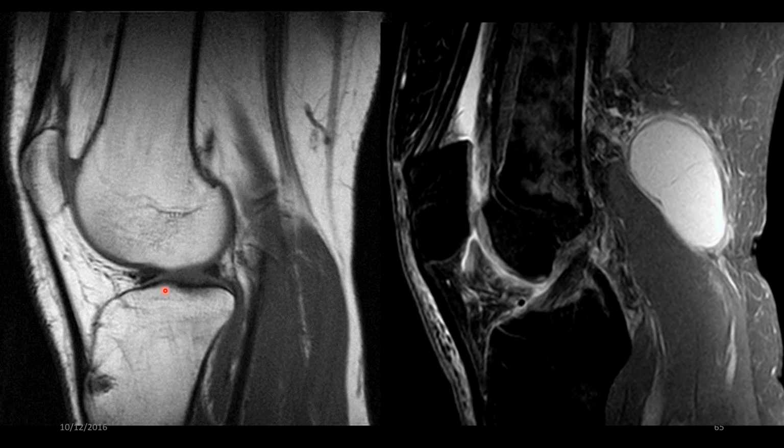This is more musculoskeletal stuff. So this is a knee, and this is a Baker's cyst behind a knee. I'm not going to do too much detail because I don't really do MRI. I want to specialize in fluoro. But I'm just going to show you some pretty pictures so you can have an appreciation of what some of the images look like. Again, this is just an introduction into medical imaging.